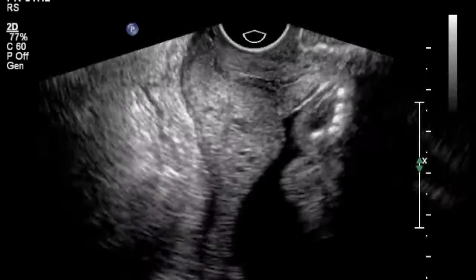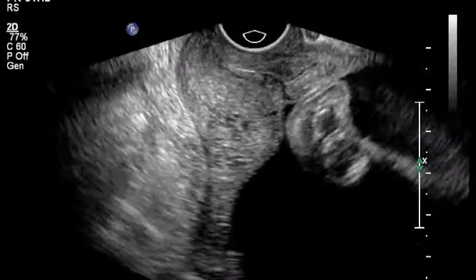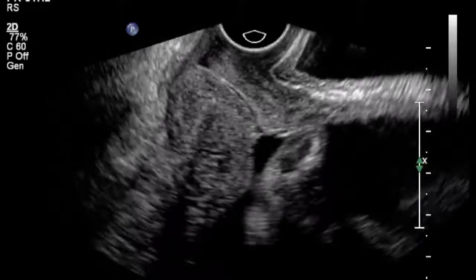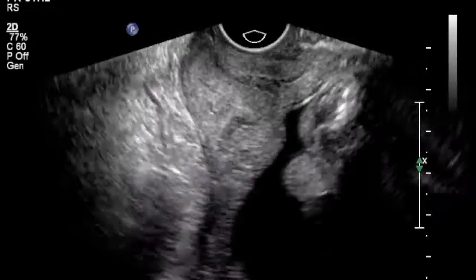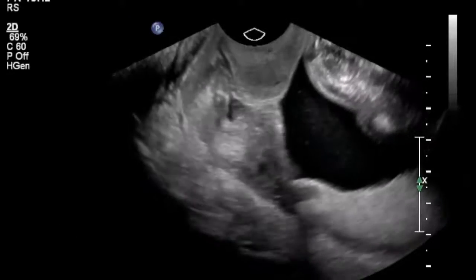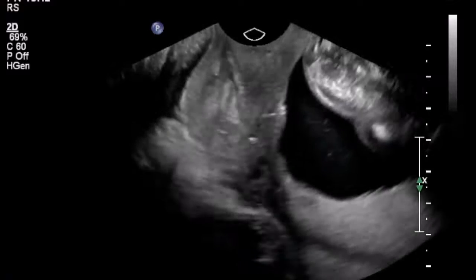This is just a short cervix, but then you wait for some time. Sometimes you see the internal os opening. As you can see here, this particular portion is quite short. So you should see to it that the internal os and the external os are properly seen there. It is usually a dynamic kind of situation. Cervix is a dynamic organ.